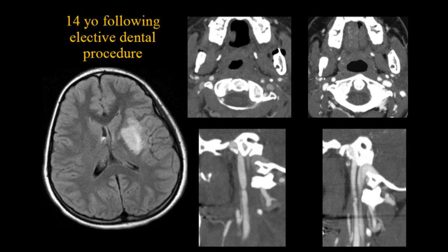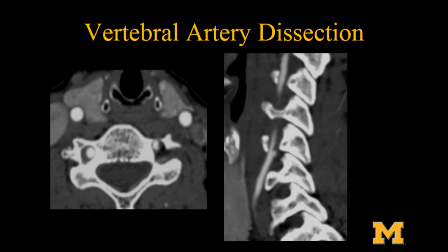This is an example of a little vertebral artery dissection just done by a little angio, a very, very easy angio to do. Nothing happened at all. The patient just complained of a little bit of pain during the procedure and unfortunately had a little dissection, and we followed this patient non-invasively again by performing CT angiography. Again, a very, very robust way.